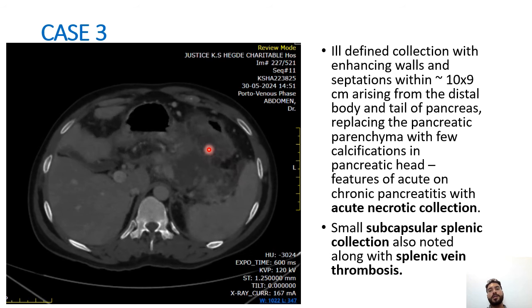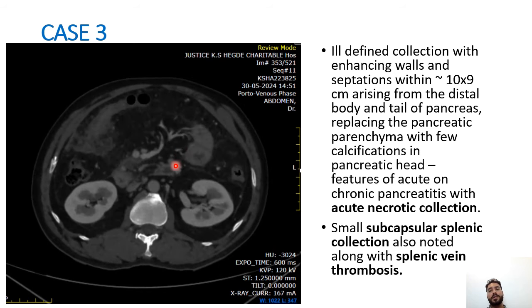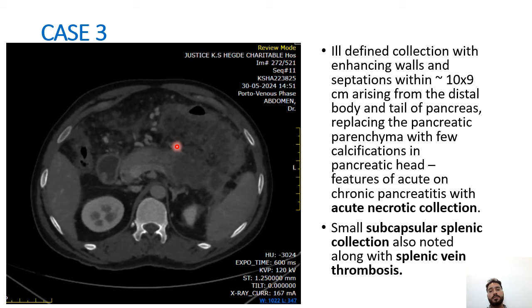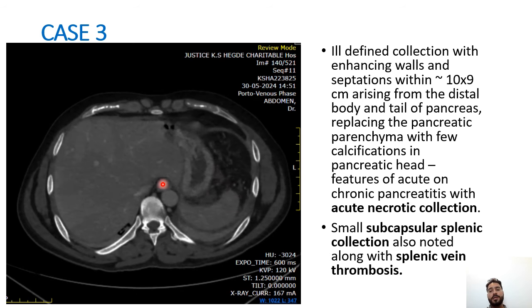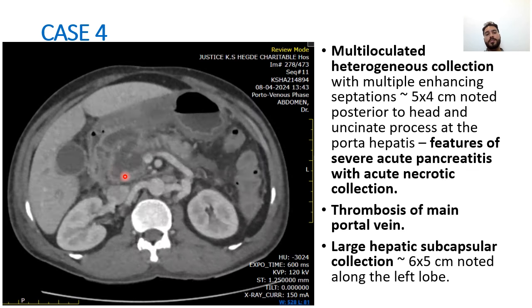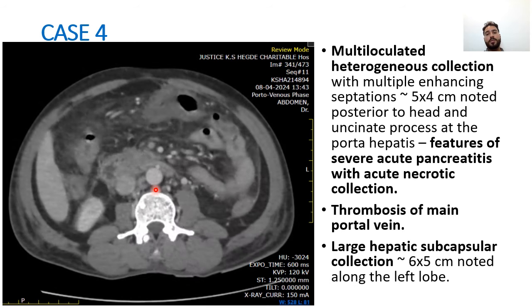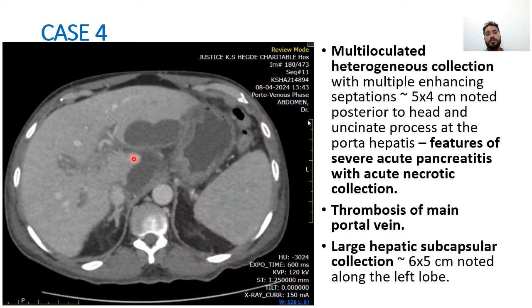This shows an ill-defined collection in the body and tail region of the pancreas replacing the pancreatic parenchyma, with features of acute and chronic pancreatitis with acute necrotic collection. A small subcapsular splenic collection is also noted along with splenic vein thrombosis. In another case, a lobulated heterogeneous collection with multiple septations is noted in the head region. Thrombosis of the main portal vein and a large hepatic subcapsular collection is seen along the left lobe.